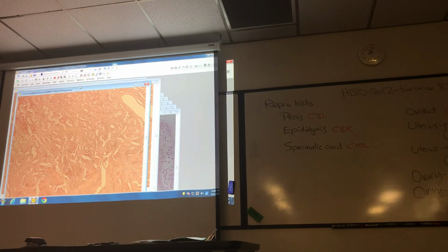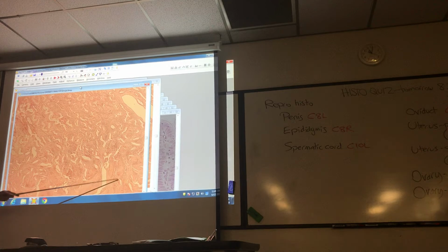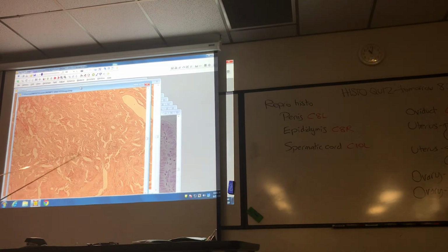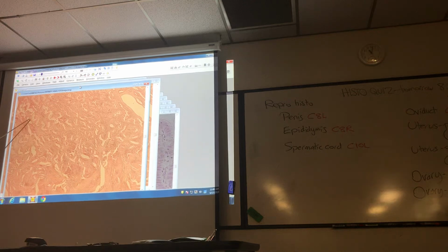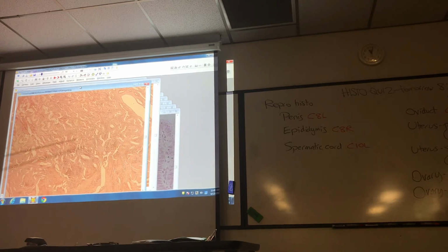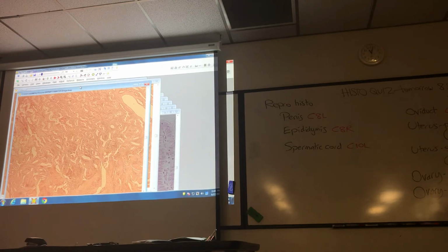So I wanted to get some of the myometrium in view. And so some of these smooth muscle fibers down there are part of the myometrium, so you can see that. And you can see the many, many uterine glands or glycogen glands. And so I feel like that's a dead giveaway for secretory phase. You could call it progravid phase. That's what the slide says. Typically books will call it now the secretory phase of the uterine cycle. Again, endometrium, myometrium.